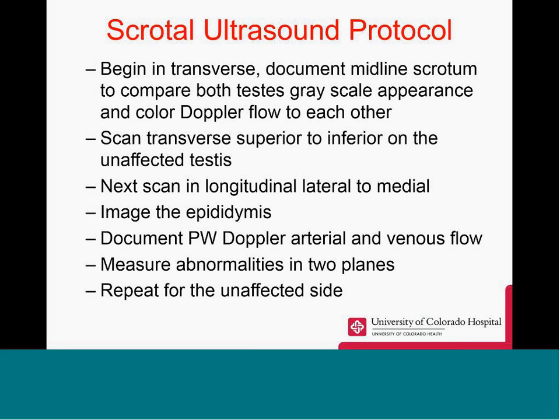We're going to document pulse wave Doppler, arterial and venous flow within the testicle itself. This is specifically important for venous flow to rule out torsion. We're also going to measure any abnormality that we see in two planes. We will then repeat this for the unaffected testis.